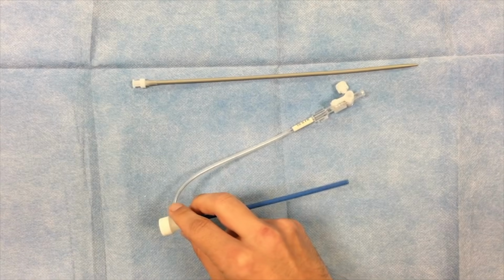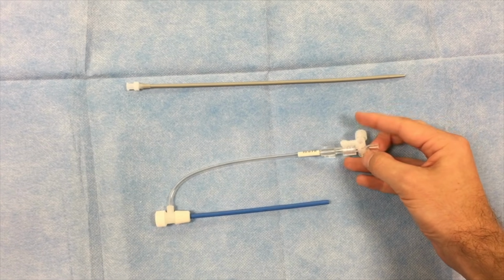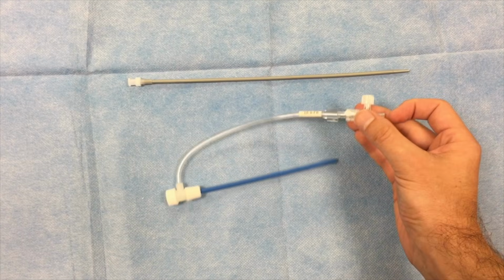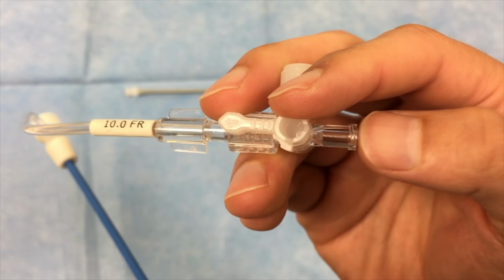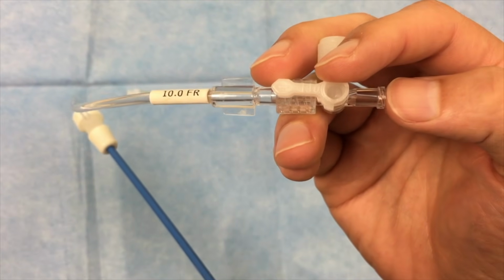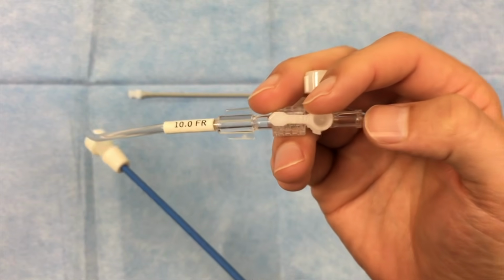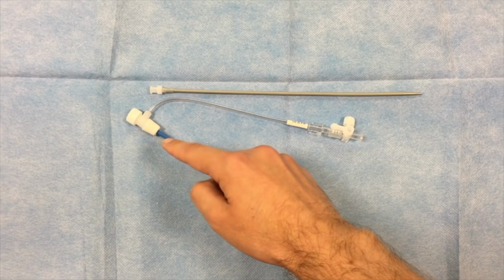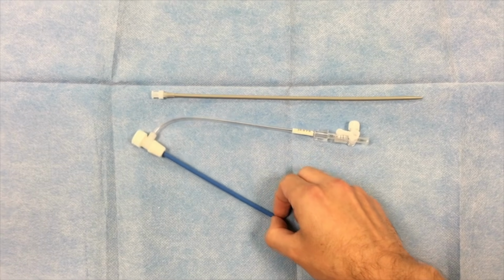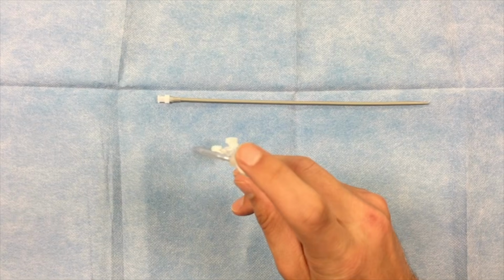of the patient. So you'll notice that attached to this sheath is tubing. You can attach various syringes to this tubing and inject different materials such as contrast. If contrast is injected through there, it will flow out of the sheath and opacify the vessel it is in. Additionally, you can hook up a saline flush, which will flow down into the sheath, and then the saline will be dripped through the sheath.